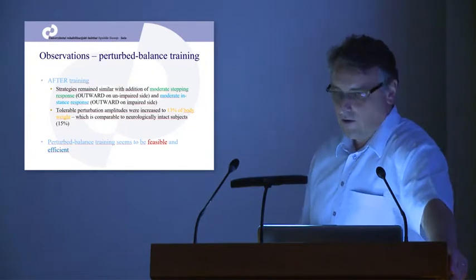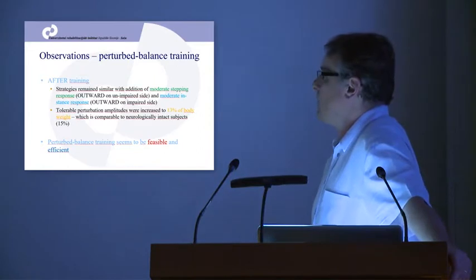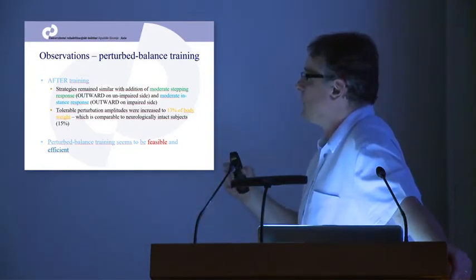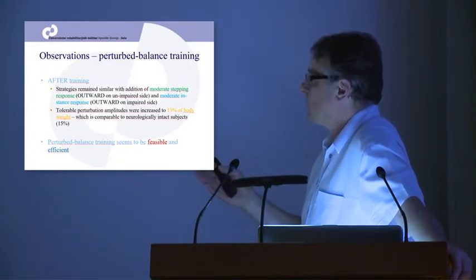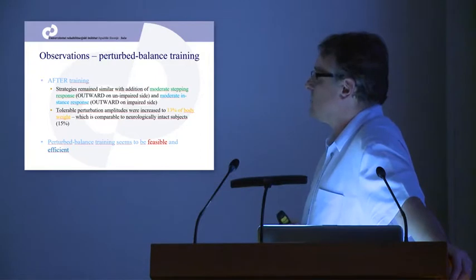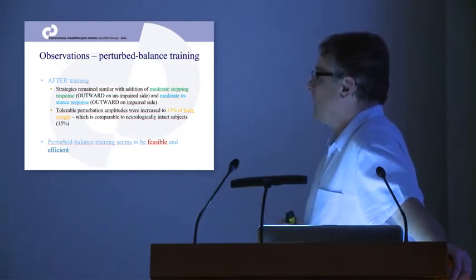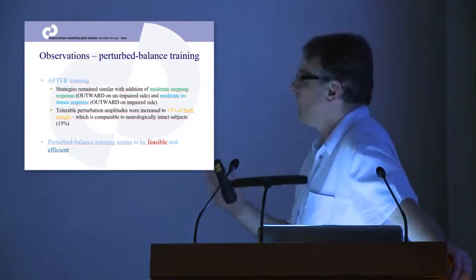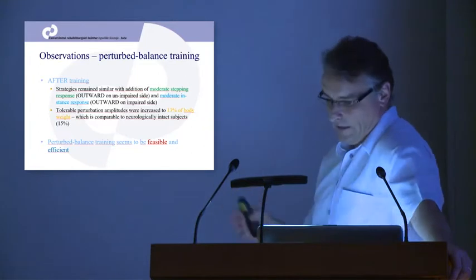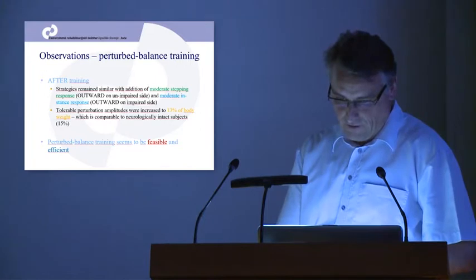After the training, we see that the strategies remained quite similar, but what we achieved is that the perturbation amplitudes that the persons can successfully negotiate increased to 13% of body weight, which is quite substantial. And we may say that this is also quite functional for their everyday activity. In that sense, this perturbation balance training seems feasible and quite efficient.